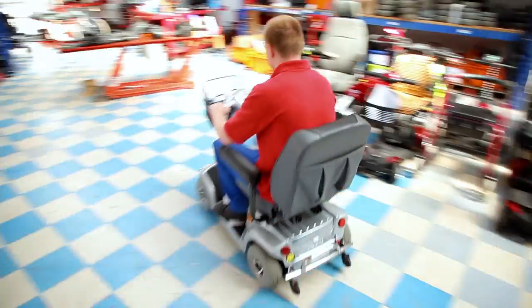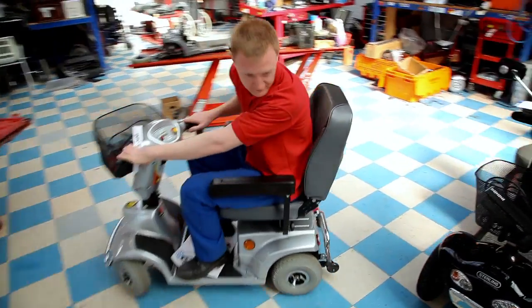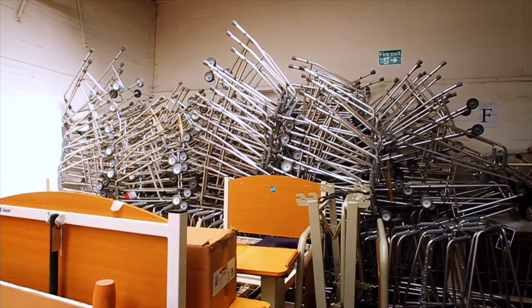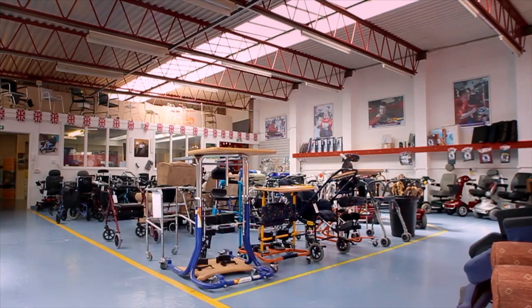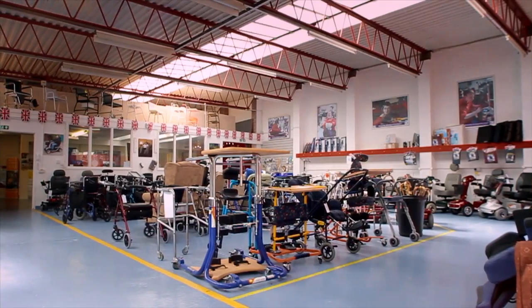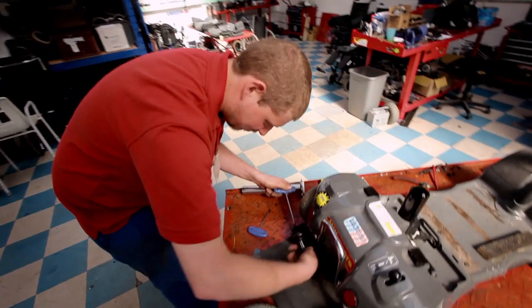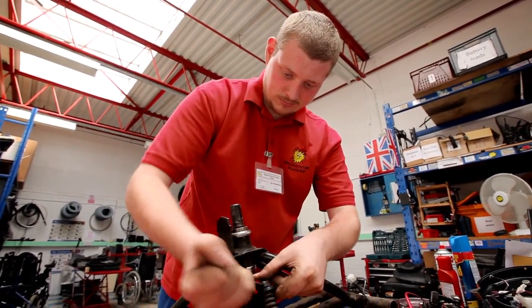There's 330,000 pieces of electric mobility equipment on the roads now. Most of the used mobility equipment is being thrown away, but 80% of them can be recycled. So we intercept any mobility equipment going to landfill, and we get them to bring them here. It comes in and gets sanitised, and then it's stripped down to its base components, and they build it back up again, and we sell it at a reasonable cost.